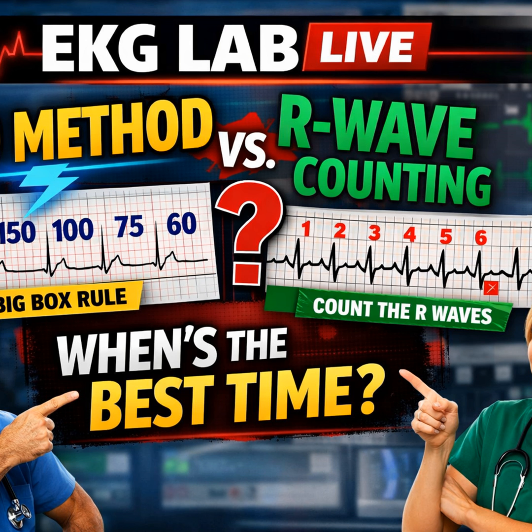So you're just looking for the magic number. I'm looking for the signature. If I see a narrow complex tachycardia and I put my calipers down and the big box method says 150 on the dot, my brain immediately screams flutter. Then I can look closer for those little sawtooth waves buried in the T waves.